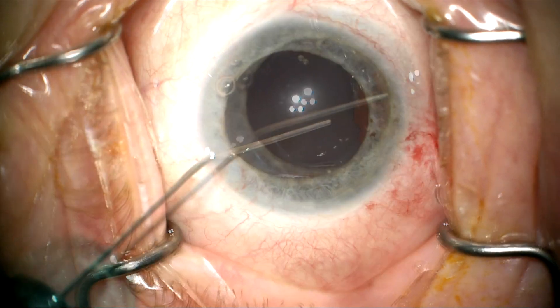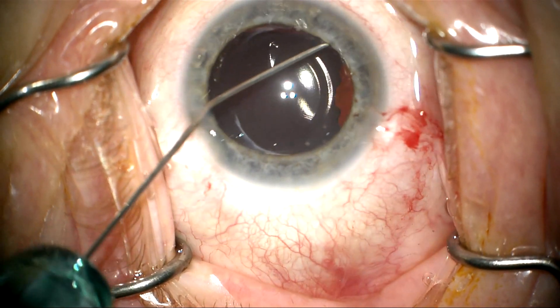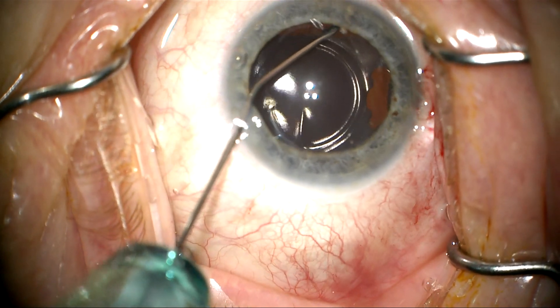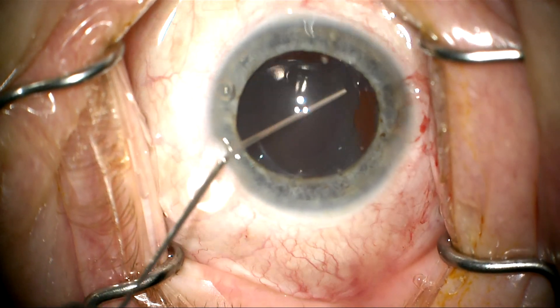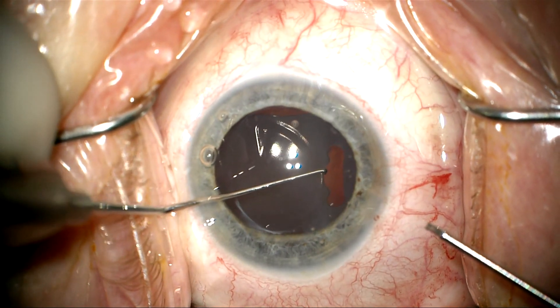I don't really know what's behind this lens because we have no view, but the ultrasound was normal. Here we're continuing to inflate the capsular bag with cohesive viscoelastic until we can get the lens a little bit mobilized.